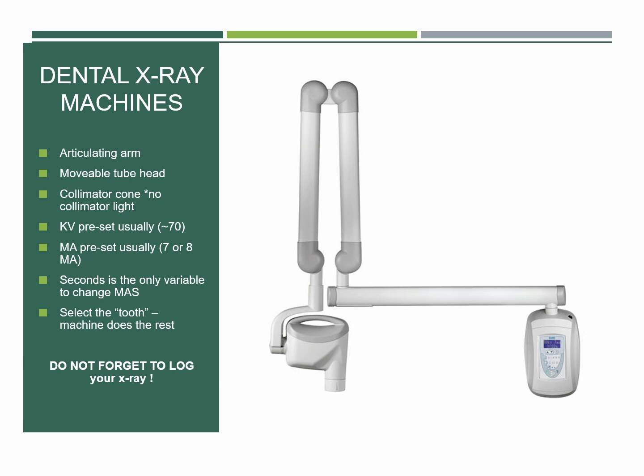How do we get these dental x-rays? Well, dental x-ray machines. You can appreciate that the x-ray machines we use for full body rads or for a thorax or a limb, they're too big and awkward when we're dealing with a mouth. Now, you can do it with a real conventional machine. We've dropped that skill, but it's something I used to have to do at certain clinics where we had to use the whole thing. And believe me, you're lucky you don't have to do that anymore. So when you're struggling with your dental radiographs with these machines, just count yourself a little bit lucky.